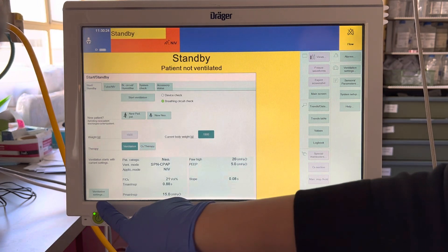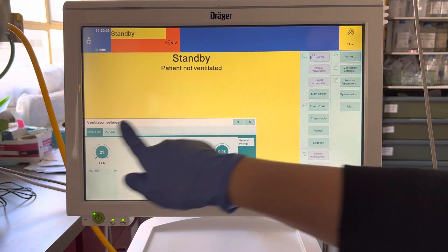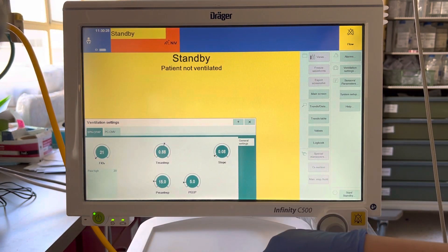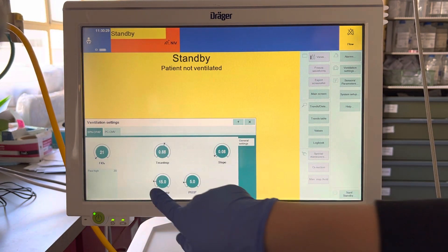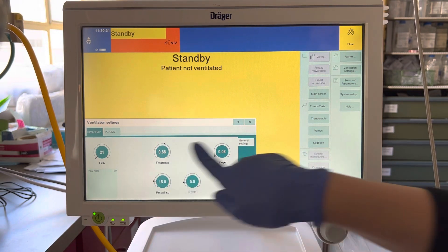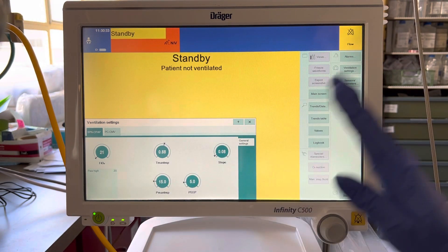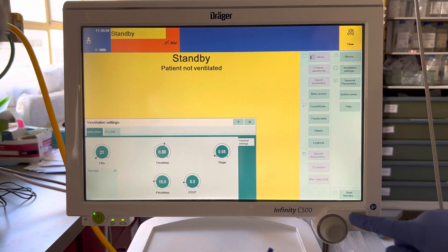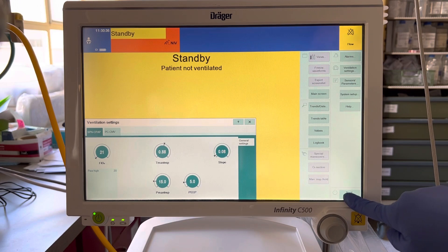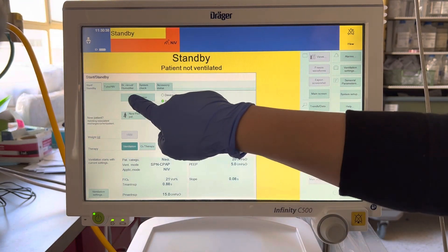Go to the settings — this is where you set up your settings. Get the settings from the physician, confirm them, and once you're ready, go back to the start and standby button and start ventilation.